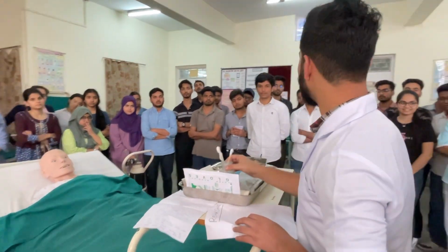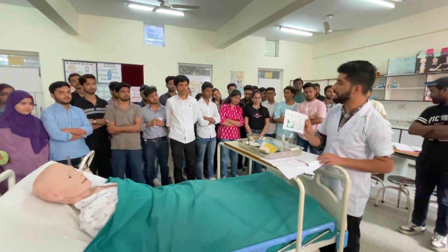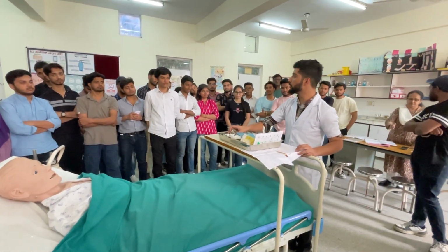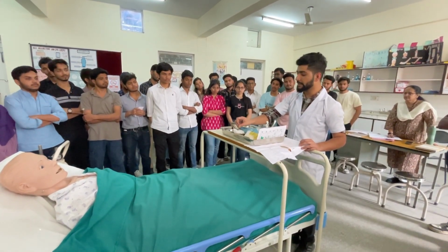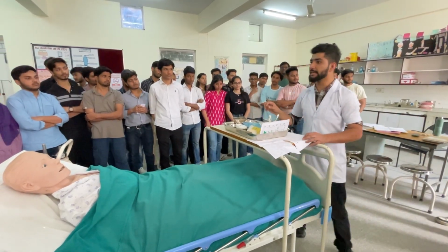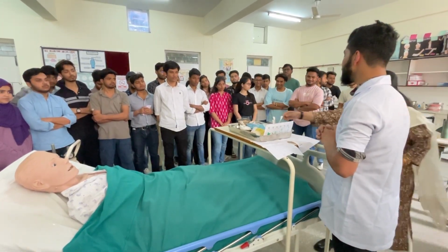This is a swab-stick to clean the nostrils. These are surgical gloves. This is micropore adhesive tape. This is a container, a kidney tray, and a bowl with water to check the patency of the tube. This is also a bowl containing gauze pieces. This is a paper bag, and this is a tray. So these are the articles required for the procedure.